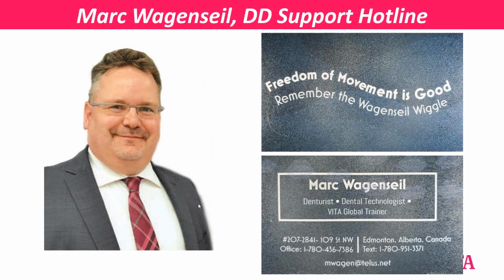Absolutely. The theory behind this was when we designed the 20-degree tooth back in the 50s, we wanted to make it a little narrower, thinking that it wouldn't interfere and it wouldn't tip the denture as much because there was less surface area in theory. And now we know that that's not the case. What we forgot was that we needed that freedom in centric along with working and balancing and some other characteristics that we have. But the freedom is where, and the chew cycle is where, the interference lies.